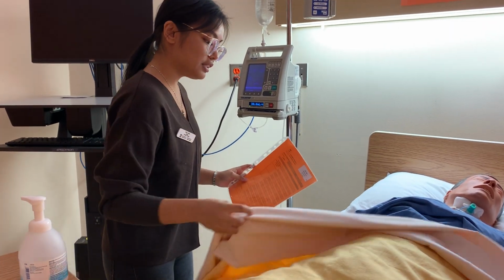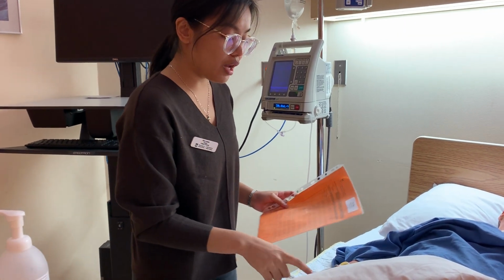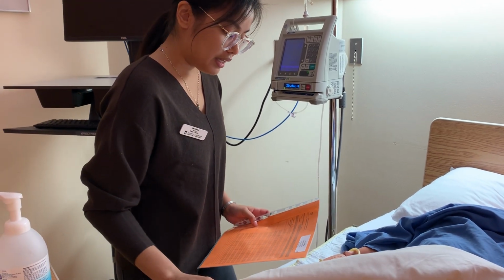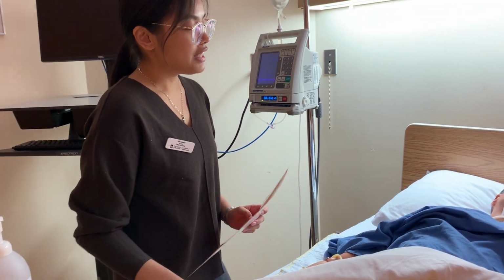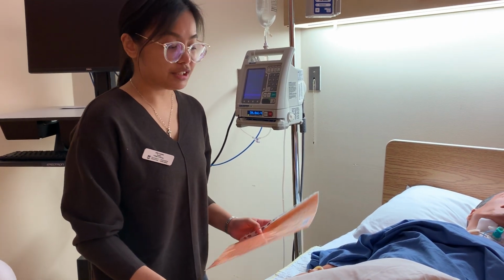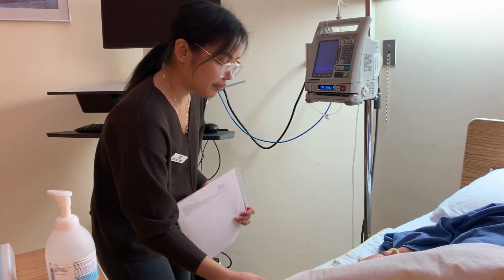So I'm checking the arm site to look at the IV site for any pain, redness, or inflammation. While I'm here, I'm also comparing my MAR to their armband. So I'm just checking for their name, their FIN number, their date of birth, their doctor, and their allergies. Can you please verbalize your name and birthday for me? Okay, great. And do you have any allergies that we should be aware of? Okay, and you said shellfish. Now, while I'm here as well, I'm checking the IV tube.